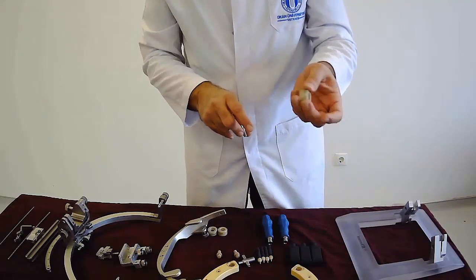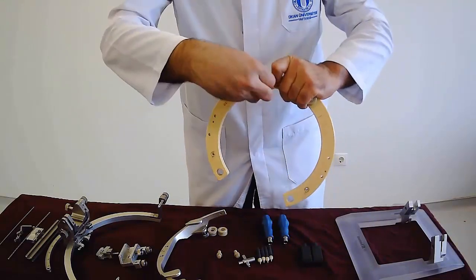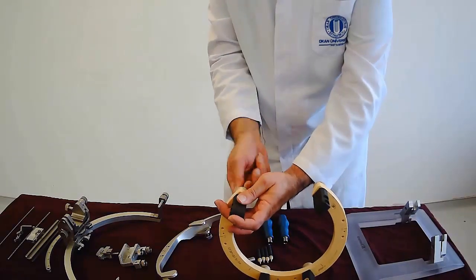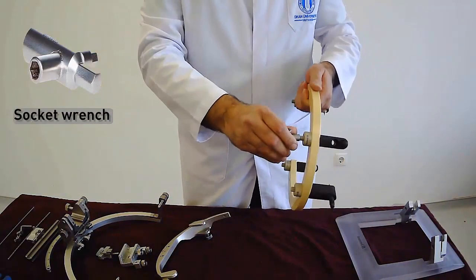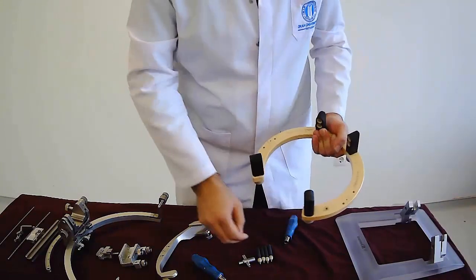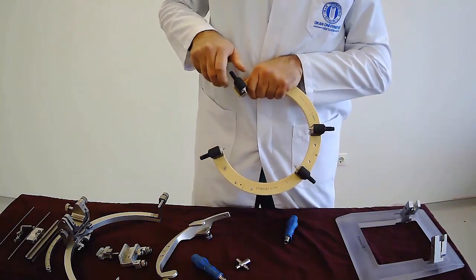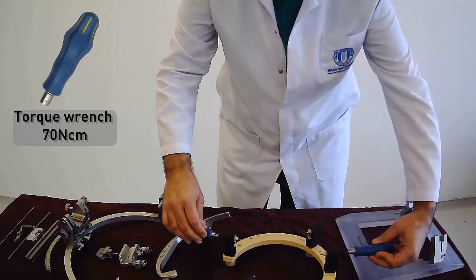The screws must be placed to the deep side of the nuts and tightened by a socket wrench. After the four fixing posts are implanted, the opti-pins are implanted into the holes of the fixing posts. The torque wrench with a 70 Ncm limit can be used for tightening the opti-pins.